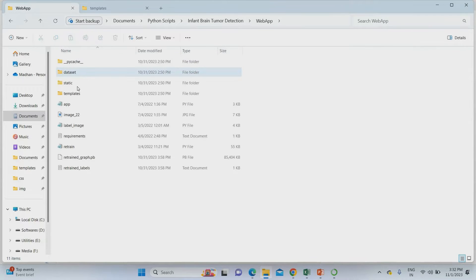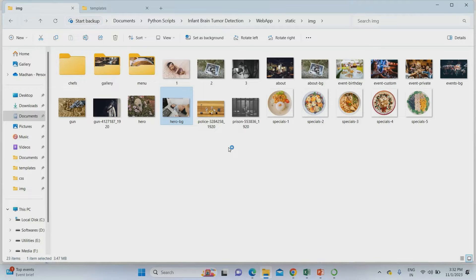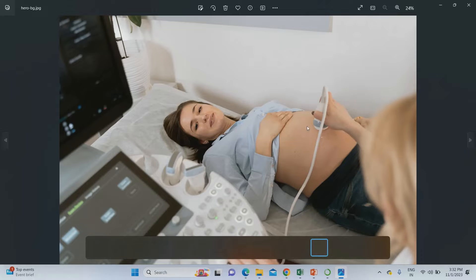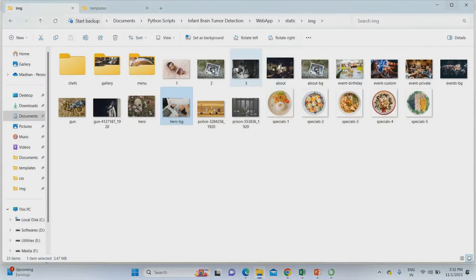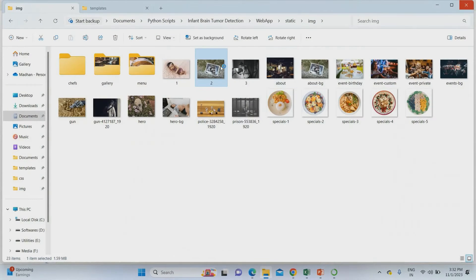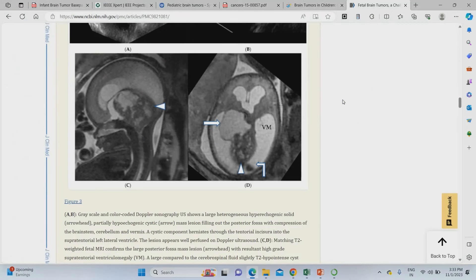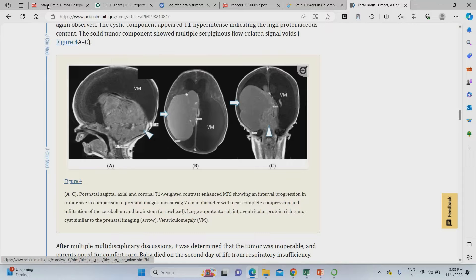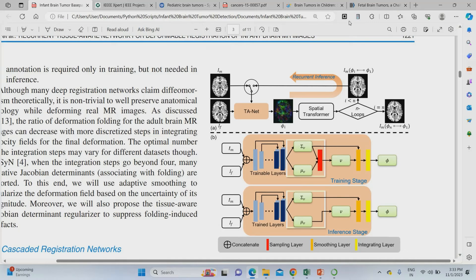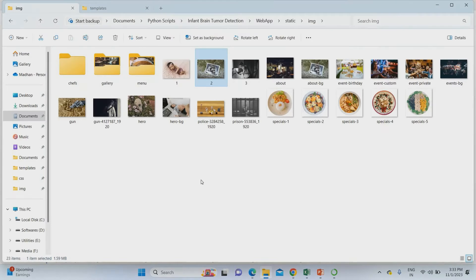Ultrasound images are taken during the pregnancy stage — each and every mother has some ultrasound scanning done. I'll show some ultrasound images for reference. This is the ultrasound process where the baby is scanned inside the mother's stomach. From this ultrasound image, we are going to find whether the baby has a tumor or not. In our proposed system, you can use both ultrasound images and MRI images — that's a major advantage not proposed in the base paper. Now I'm going to open and explain the project PPT.